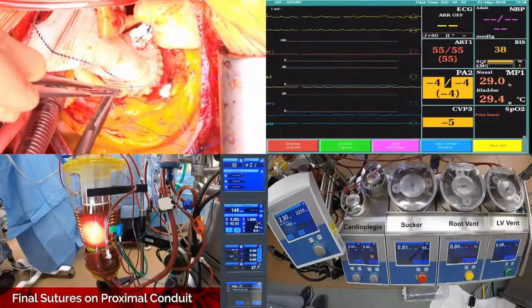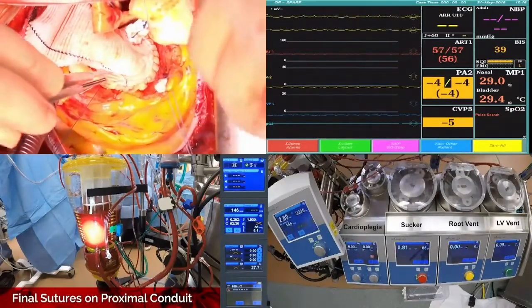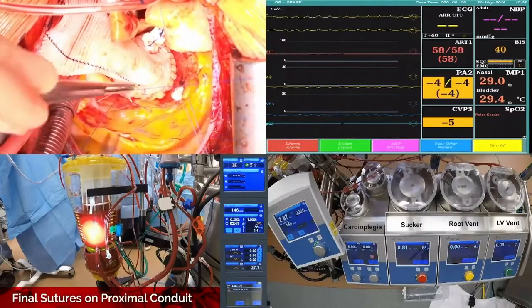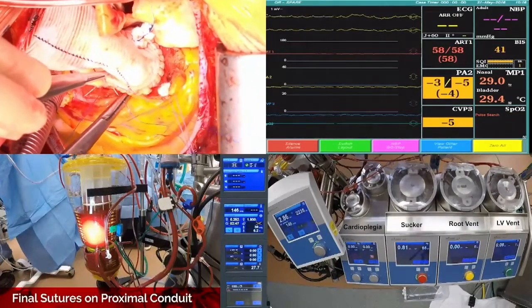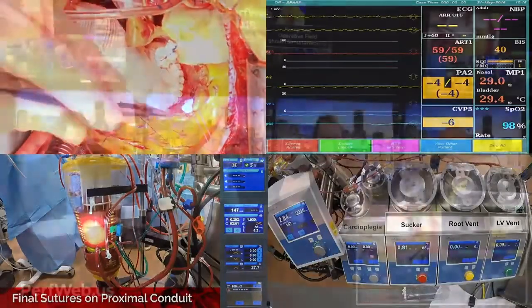But bottom line, at the end of the day, when we come off, it doesn't look that good on echo. So we never reversed and went back on; I went through the graft itself and just replaced it. Now I think this is going to be interesting for Shelley because Shelley sees this part. She can easily see what you're doing here.